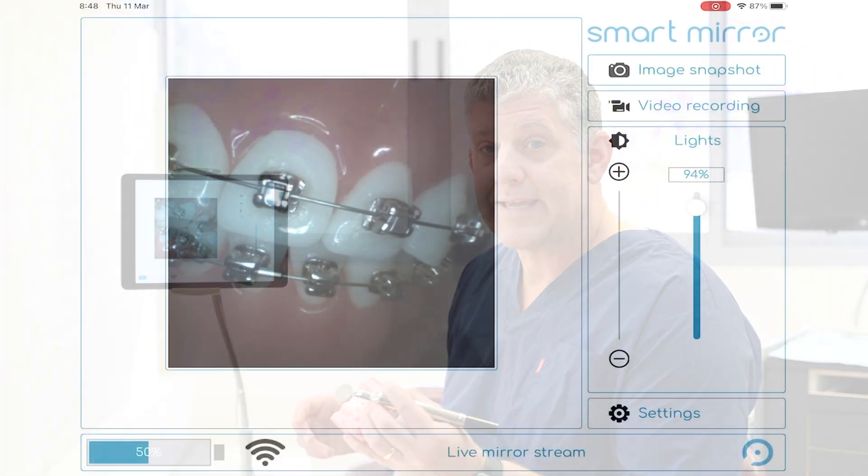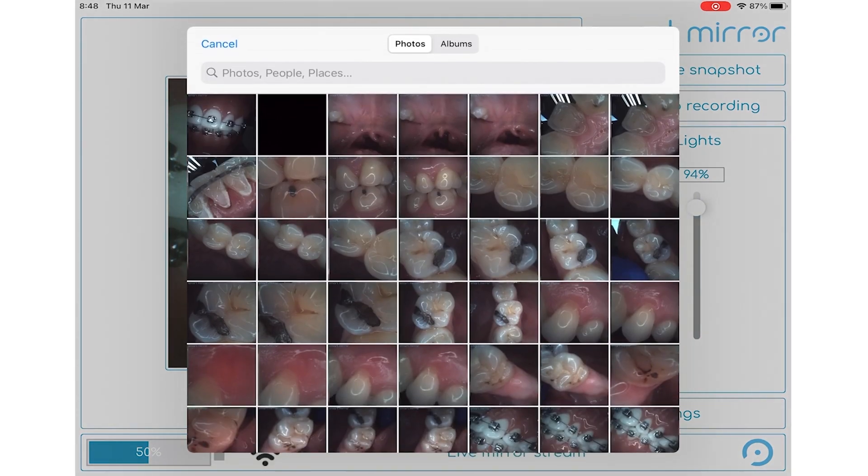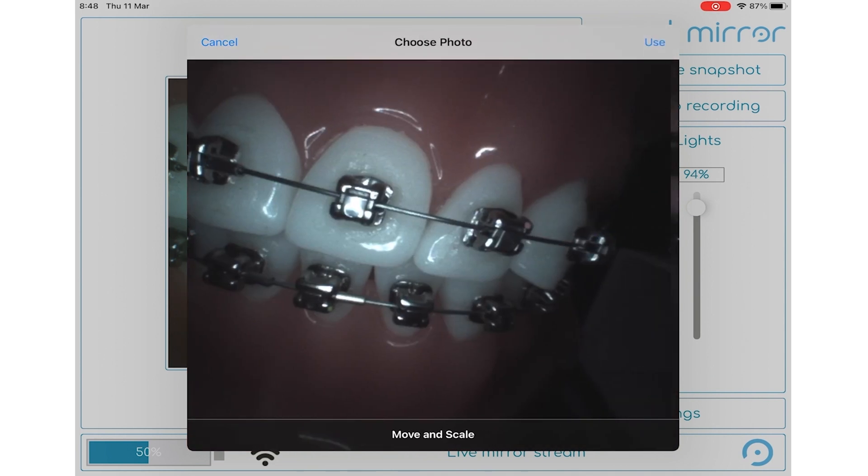In this video, I'll dive deeper into the SmartMirror app and I'll show you how I capture and manipulate images in my office. Using the app couldn't be simpler. To capture a still image, take an image snapshot. I can inspect that image from the SmartMirror folder and I can use it or take another one.